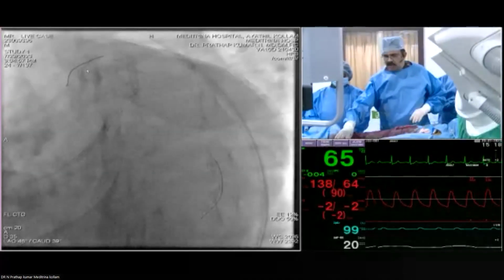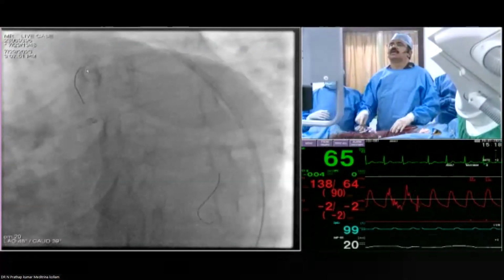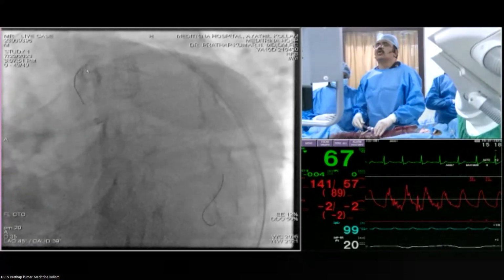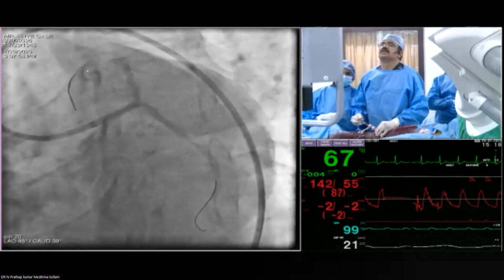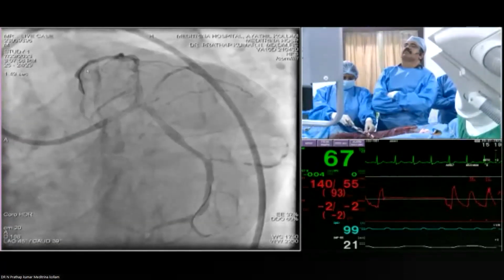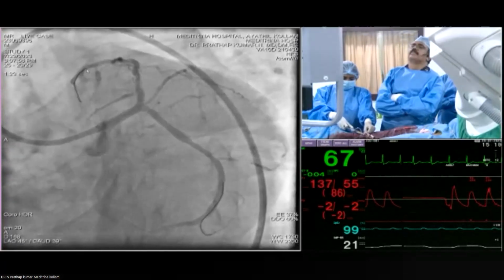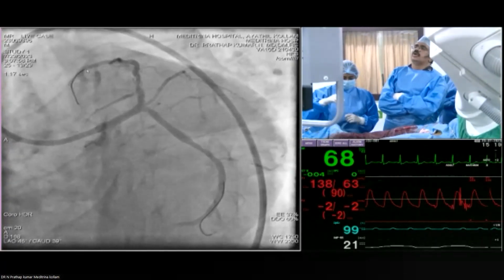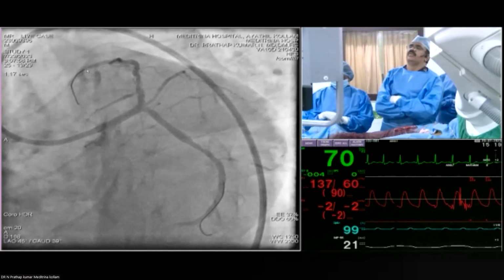Now, this is actually the situation I am standing in. So now I'll take an injection to understand whether to do balloon dilatation, or just go for the stent. This is the preparation I have done so far. But your suggestion was to stent now first from left main to circ, or to LAD? To circ. Only then can we do a DK crush.